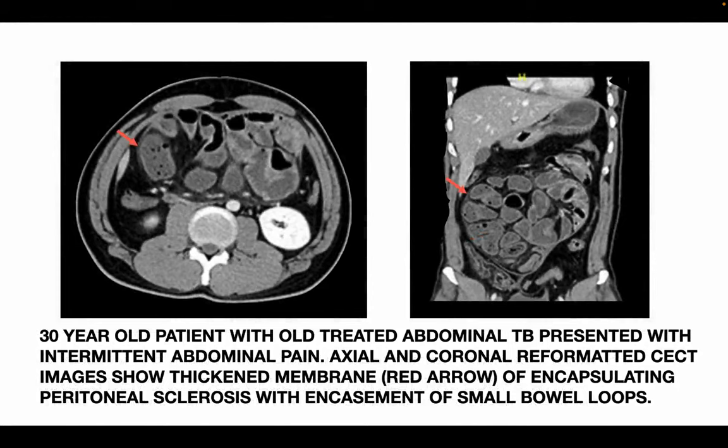This is another case of a 30-year-old patient with old treated abdominal TB who presented with intermittent abdominal pain. Axial and coronal reformatted images show a thickened membrane (red arrow) of encapsulating peritoneal sclerosis with encasement of the small bowel loops.